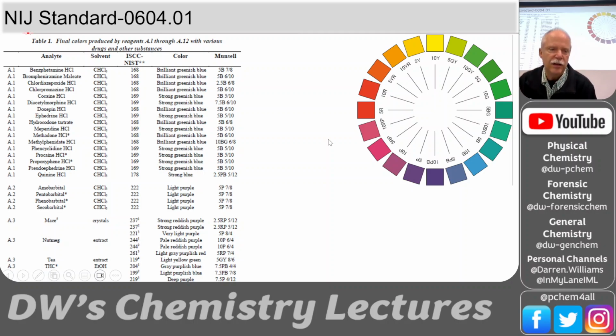Now, I went ahead and found the NIJ standard. It was referenced in the text, so I went out and found it and put it on the blackboard. If you're curious, you can look at all the different substances you can test with color tests and see all their different colors. Here's the first part of the table.